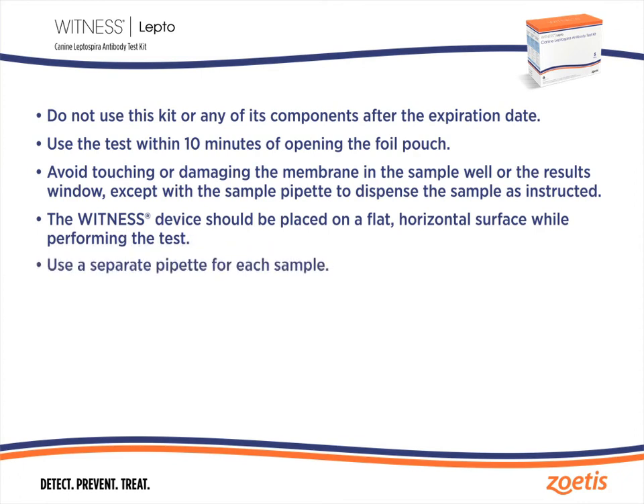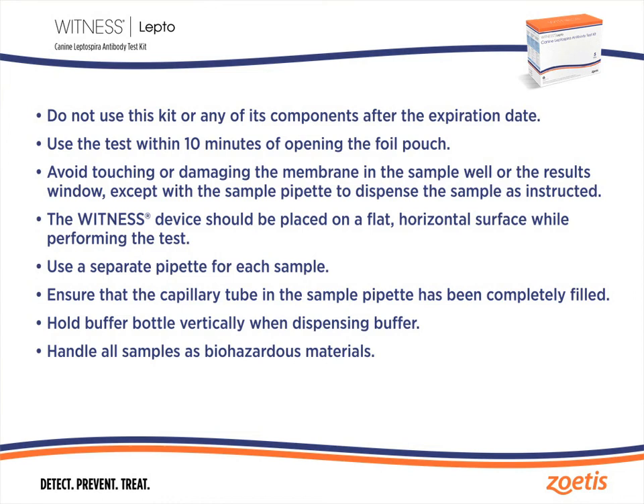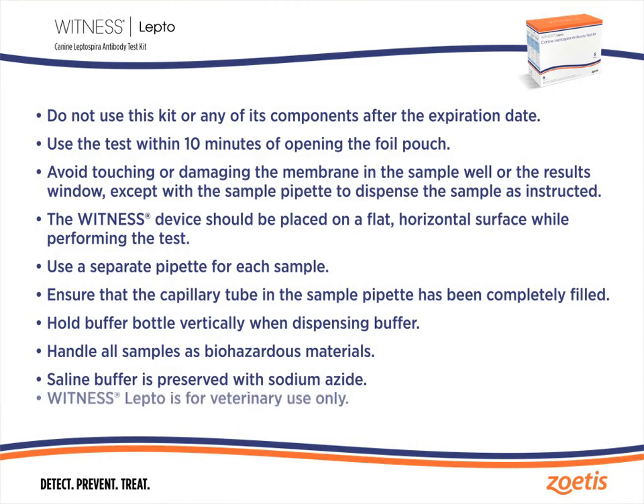Use a separate pipette for each sample. Ensure that the capillary tube in the sample pipette has been completely filled. An air bubble will be visible at the top of the capillary tube if it has not been completely filled. Hold the buffer bottle vertically when dispensing the buffer. Handle all samples as biohazardous materials. Saline buffer is preserved with sodium azide. Witness Lepto is for veterinary use only.